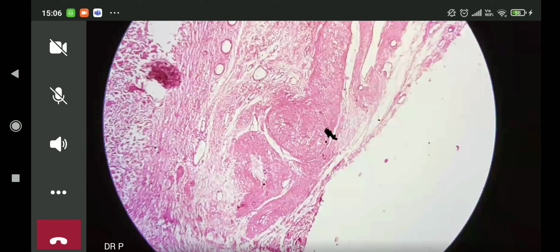Okay, I'll give you a hint. So the holes are the smaller blood vessels, the arterioles. But what is the fat looking thing at the center? Any guesses? You make any wild guesses also. What do you think it is?